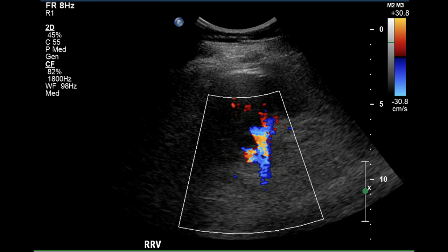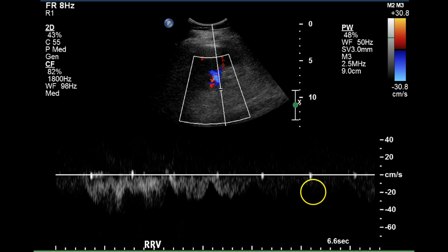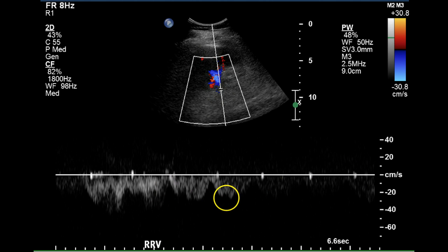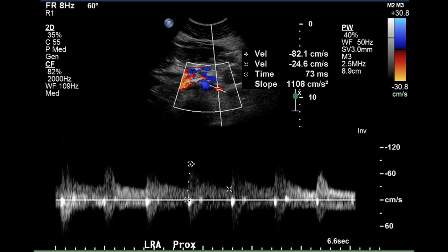An image of the right renal vein demonstrates that it fills with color flow and has a normal venous pattern. It has some sharp pulsatility, which is likely due to movement of this vein by the highly pulsatile renal artery adjacent to it.